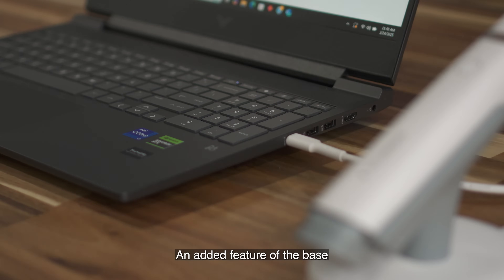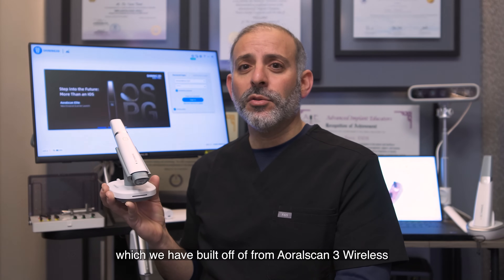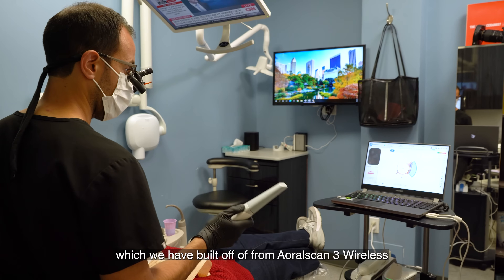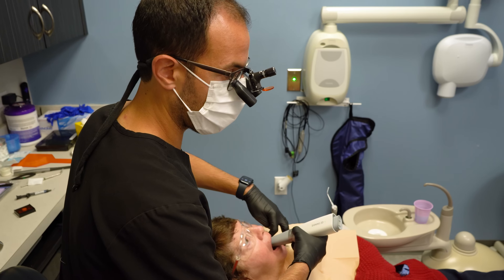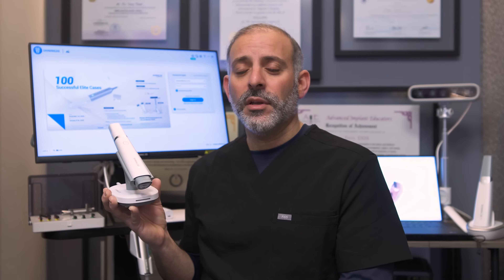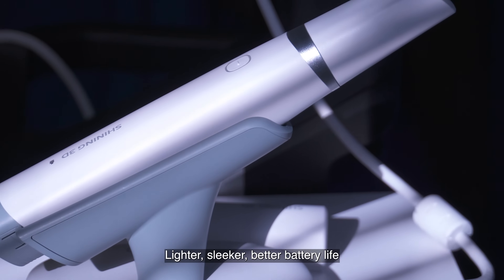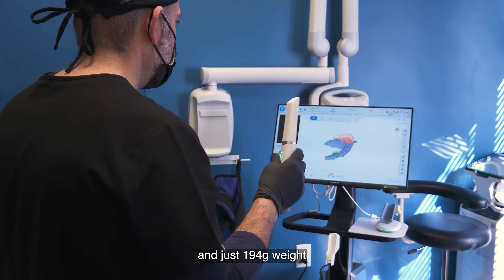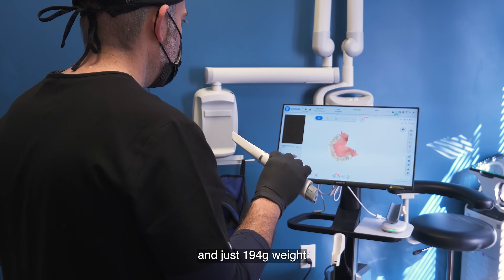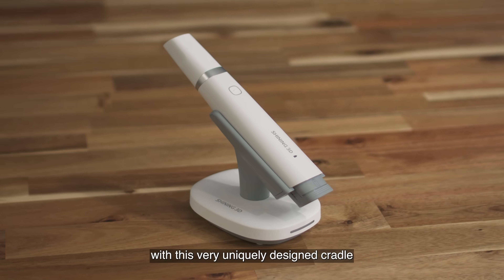An added feature of the base is that it contains Wi-Fi 6 technology, which we have built off of from our Aoral Scan Wireless 3. Learning from all the technology of the Aoral Scan Wireless 3, we've created an even finer device — lighter, sleeker, better battery life — and just 194 grams weight with this very uniquely designed cradle.